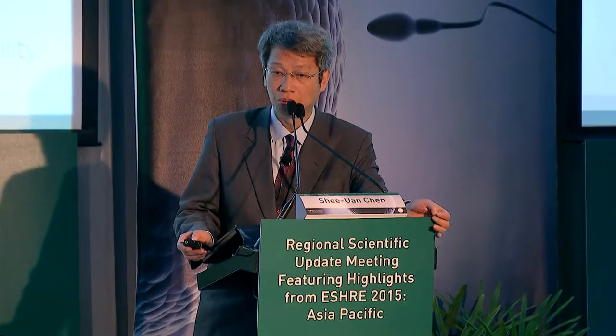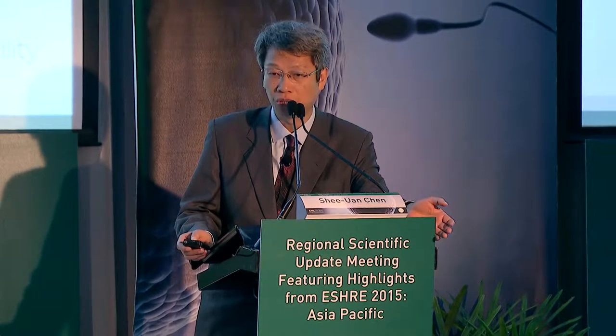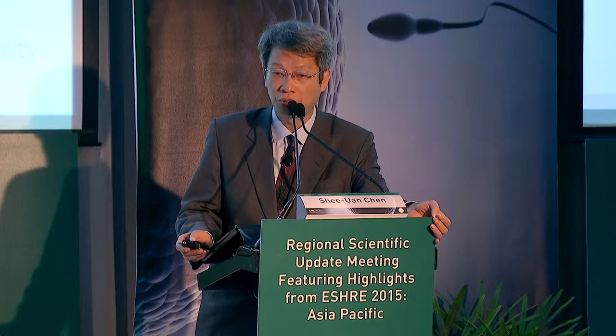Is it worthwhile to vitrify them? Usually, when we see multinucleated embryos, we will not transfer fresh. But sometimes, we may cryopreserve. How about the pregnancy outcome when you transfer these multinucleated embryos? And we will discuss the closed system for the vitrification.